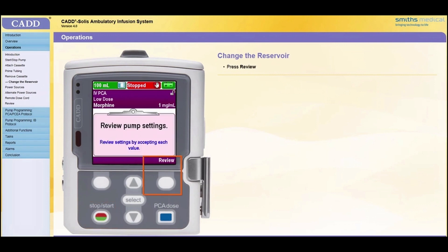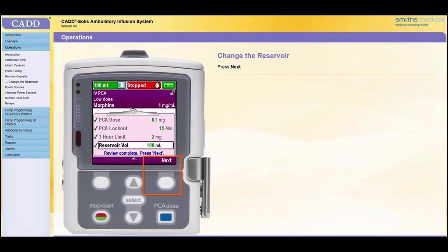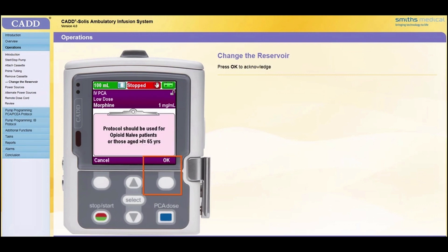The pump will prompt for a review of the delivery parameters since the reservoir volume value was reset. Press Review. Review the delivery parameters and accept the values by highlighting each one and pressing Accept Value. When the review is complete, press Next. Review any clinical advisory note that may be entered for the selected protocol. Acknowledge by pressing OK.